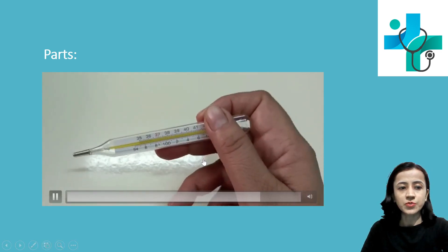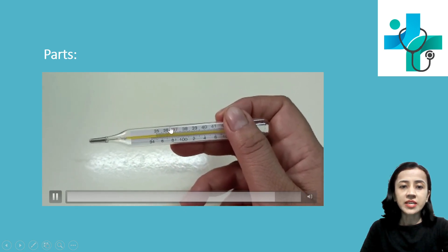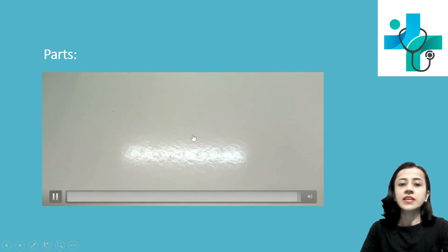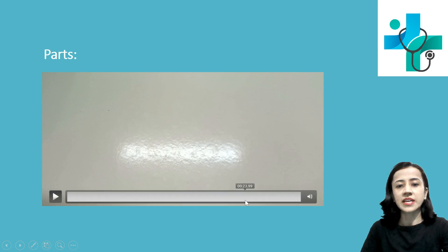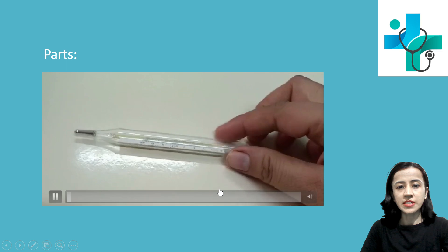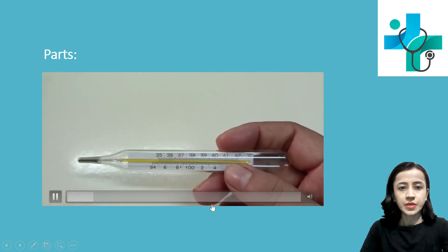You can see here this way. There are markings on the thermometer. On one side markings are in degree Celsius and on the other side markings are in degree Fahrenheit. You can see here, okay.